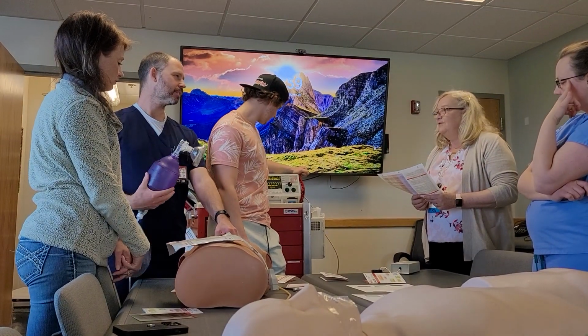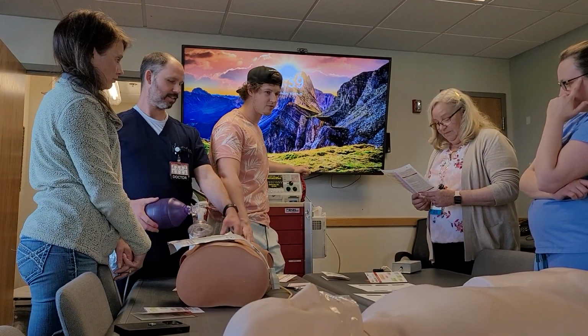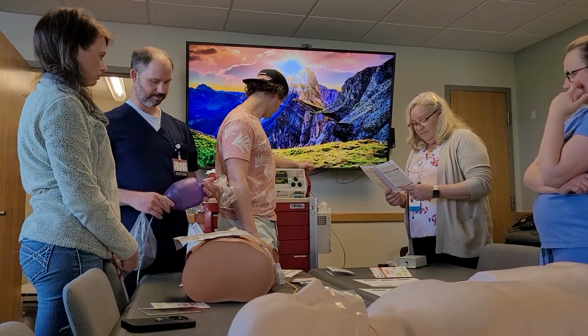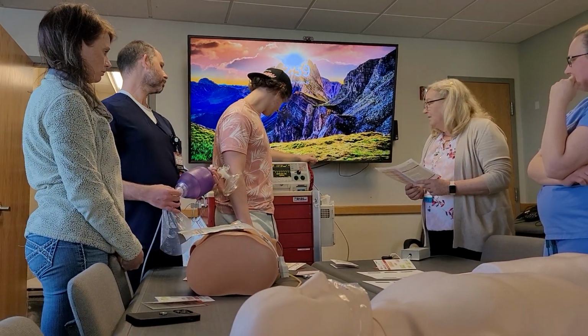How's the pulse? Alright, and breathing? They're breathing. They're breathing? Alright. Okay, so now we're gonna do ROSC. Ross, do you want to cardiovert this?